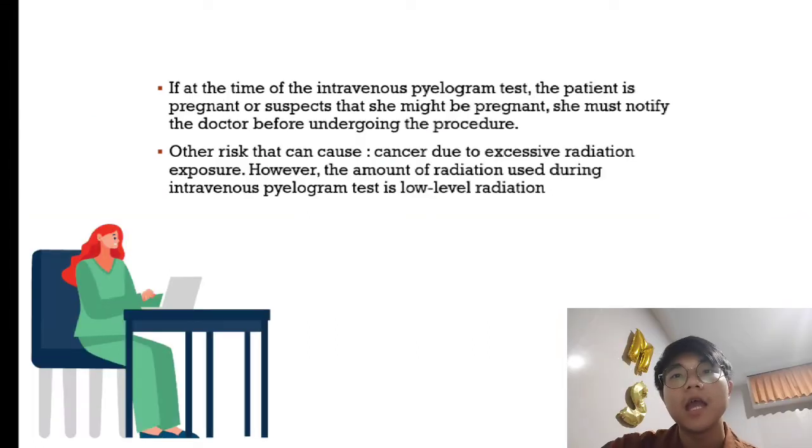If at the time of the intravenous pyelogram test the patient is pregnant or suspects that she might be pregnant, she must notify the doctor before undergoing the procedure. Even if the risk to the unborn baby is small, the doctor will consider whether it is better to wait or use other imaging tests. A risk that can also occur is cancer due to excessive radiation exposure. However, the amount of radiation used during the intravenous pyelogram test is low-level radiation, so the risk of damage to cells in the body is very low.